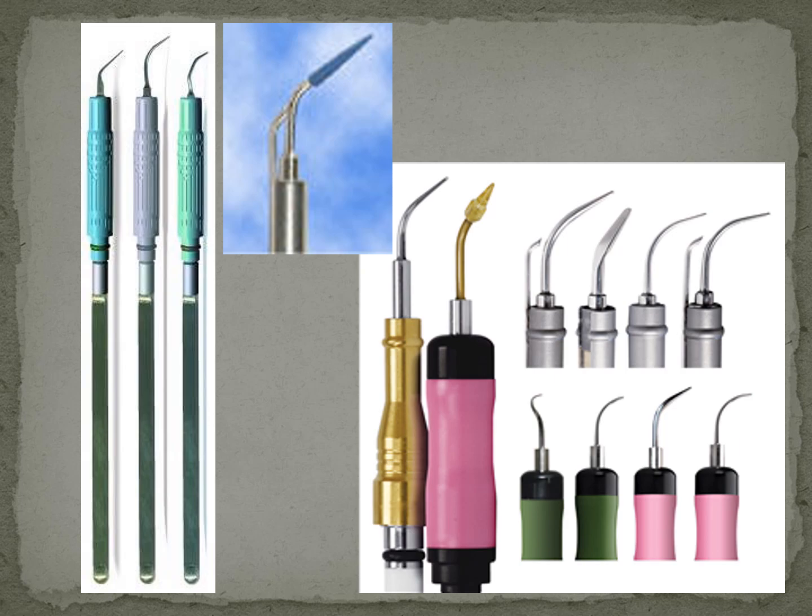Now there are a million different types of tips that we can use. So there's going to be tips that are going to be for mesial. There's going to be tips for distal. There's going to be tips for lingual. There's going to be tips for facial. There's going to be universals, so we can use them wherever.